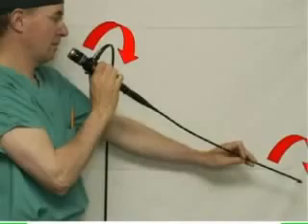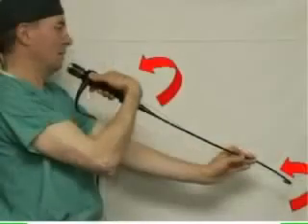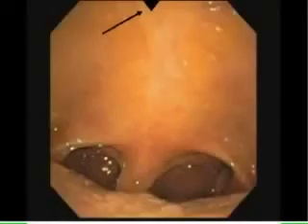To flex the tip in any other plane, the entire scope must be rotated clockwise or counterclockwise. Many bronchoscopes have a triangular marker or divot located at the 12 o'clock position at the periphery of the scope's field of vision. This marker helps the practitioner maintain spatial orientation as the tip of the scope always flexes in the diametrical plane of the marker.